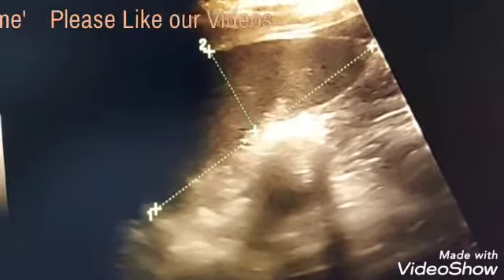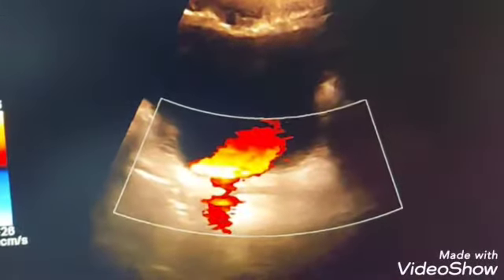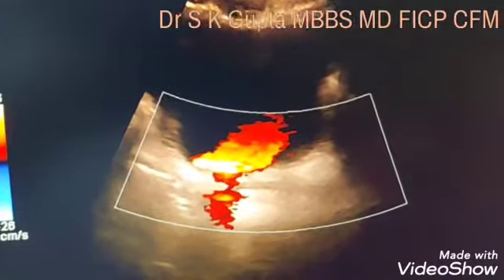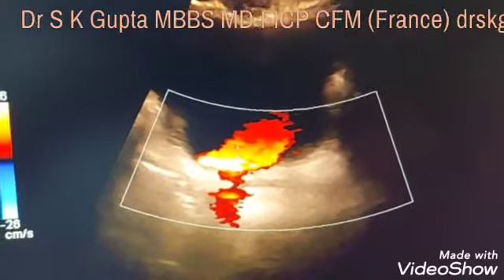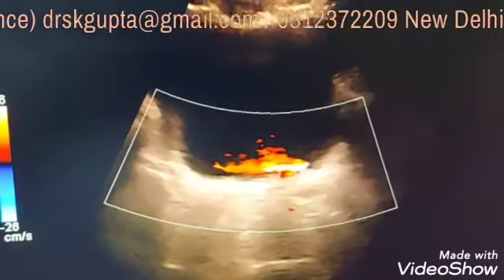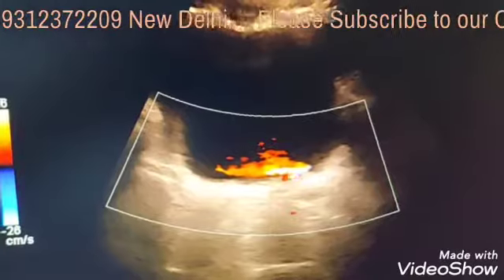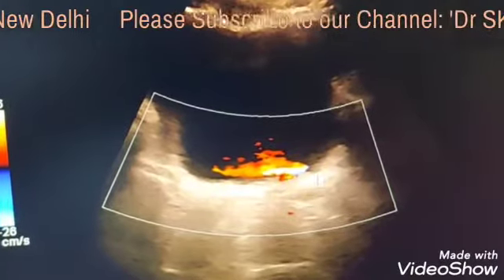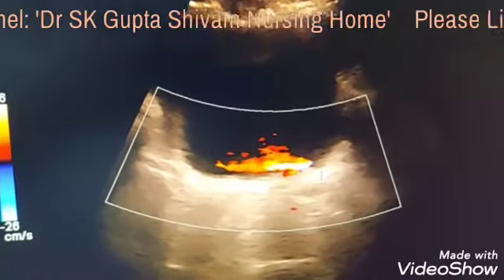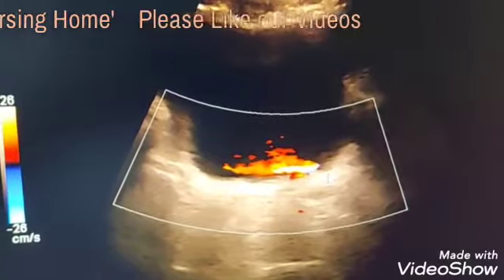When the kidney is not there, what I do is go and see the bladder, and I find there is a beautiful jet of urine from the right side into the bladder. And if I see the left hand side, I find that the jet of urine is coming from the left ureteric orifice also. It means the kidney has to be somewhere in the abdomen and it is a normally functioning kidney.